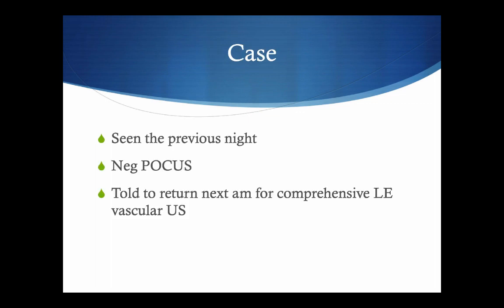So just a little bit more about her. She was seen the previous night. She had a negative point-of-care ultrasound for DVT, but told to come back the next morning. You got to come back tomorrow to get the word I hate, formal, let's say comprehensive or consultative ultrasound study.